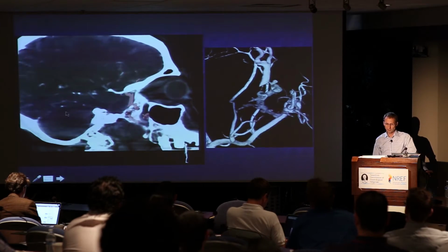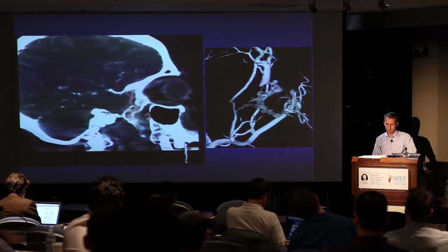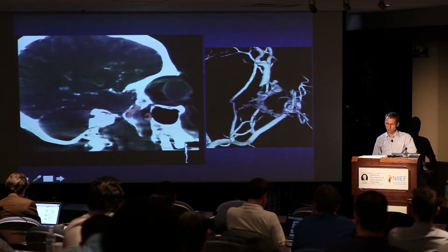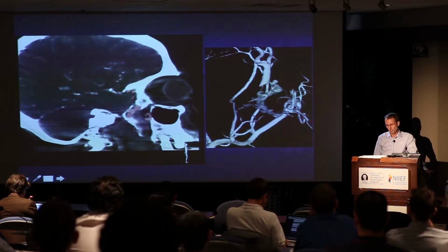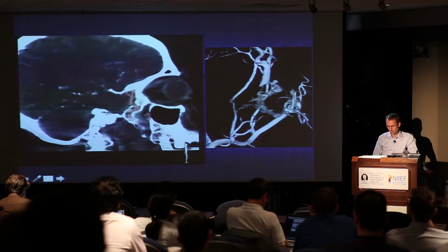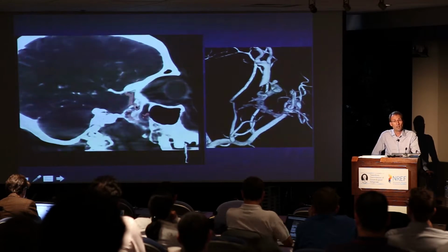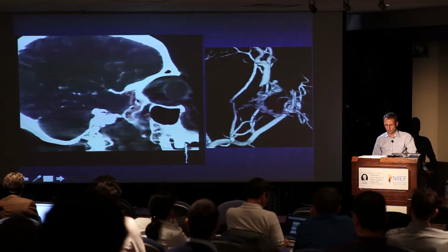The white is the 3D angiogram we did of the internal circulation, and you can see beautifully that this bizarre dog-shaped thing is actually a fistulous pouch in the sphenoid wing at the skull base. As we go back, you can see right here is a little hairpin connection where it becomes intracranial, and these are the cortical veins that are now running retrograde.